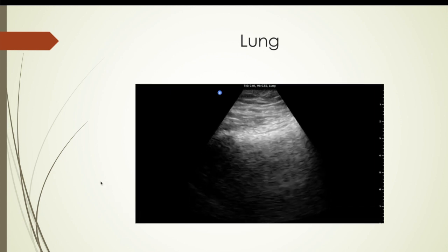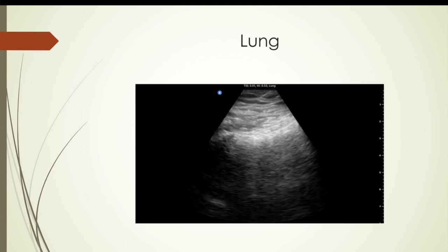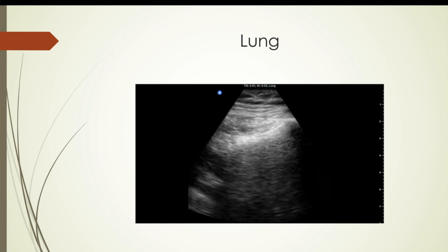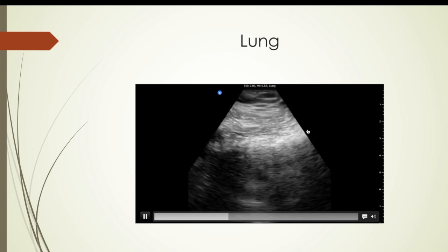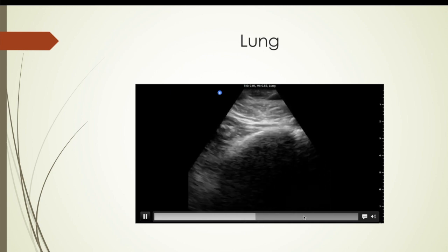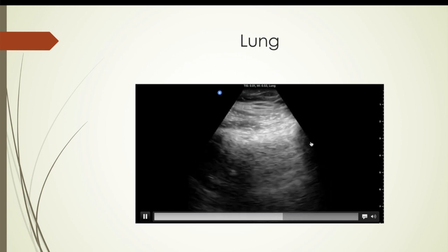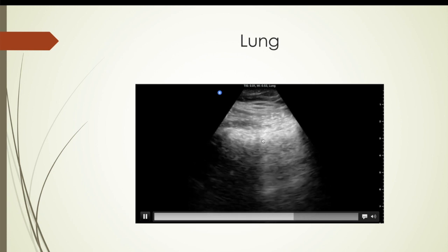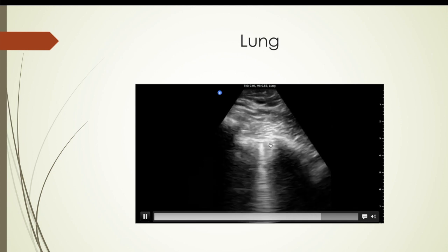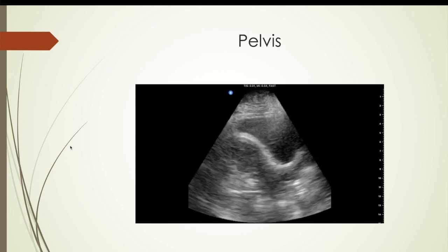Here is the lung. I had this on the FAST setting, though they have a dedicated lung setting that actually gave a much better picture. But even with the FAST setting it's still easy to see the sliding pleura, rib shadows, etc. You can see the pleura up here, rib shadow there and over here, and see the twinkling going back and forth. Very easy to rule out pneumothorax.